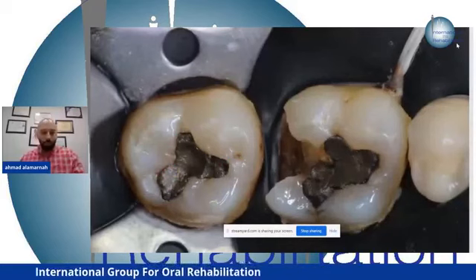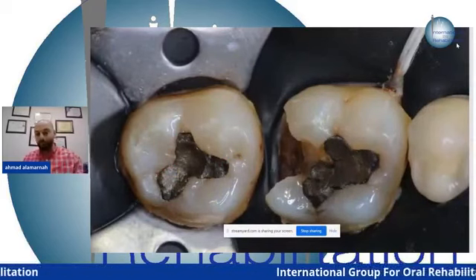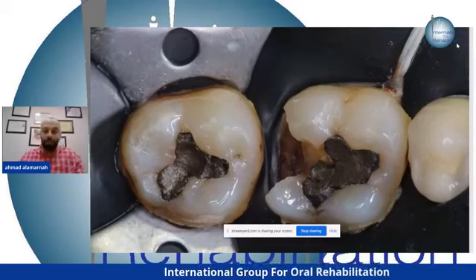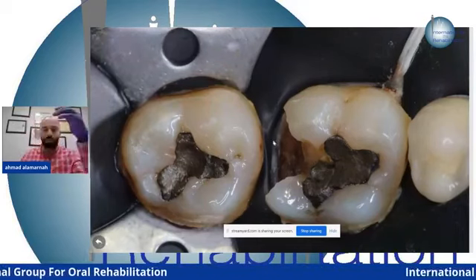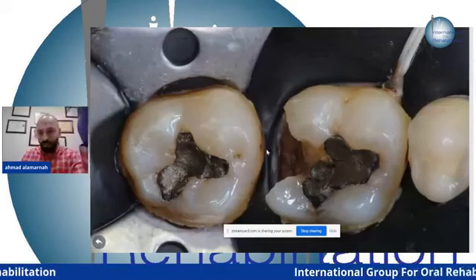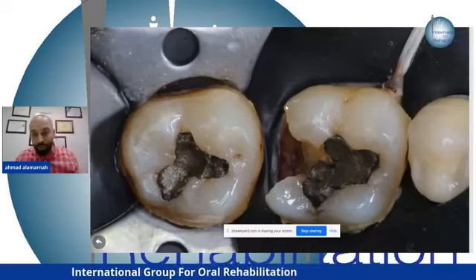It's a very good isolation. I isolate the 7, the 6, and the 5. Look at the enveloping of the rubber dam around the sulcus of the tooth.